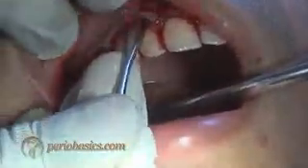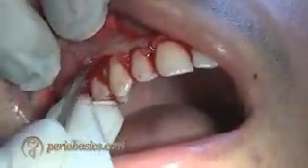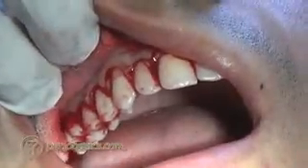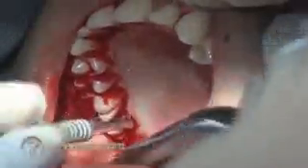There should be approximately 0.5 to 2 millimeter of bone exposure, because our main motto during this surgical procedure is to expose the bone defects. So only the marginal bone is exposed. Overexposure is not going to help in any way.